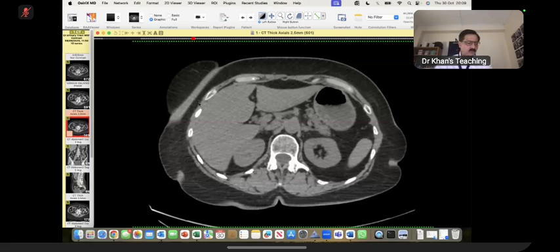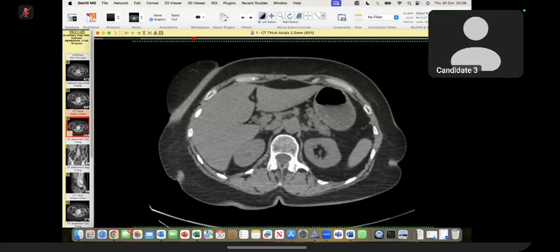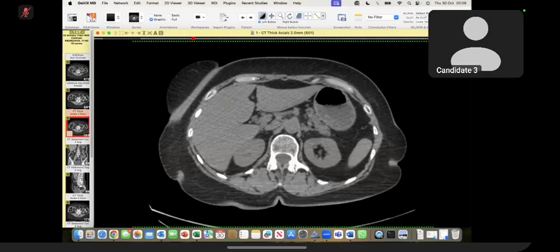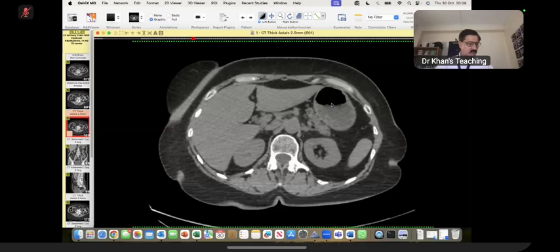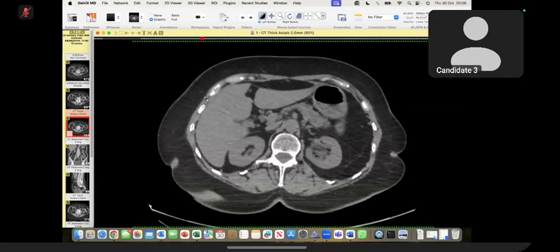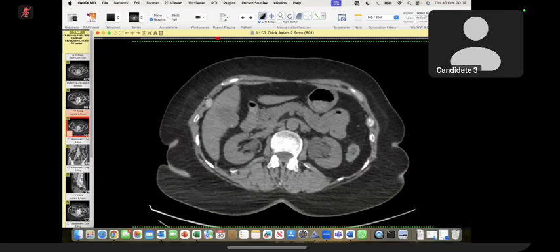Over to you. Yeah, okay. Shall I request control? Yes, please. Okay, I requested. Yeah. It's not, no. Yeah, it's scrolling now. I think, yeah.